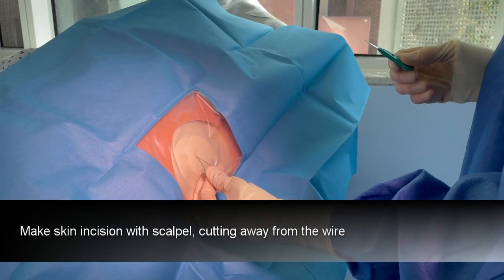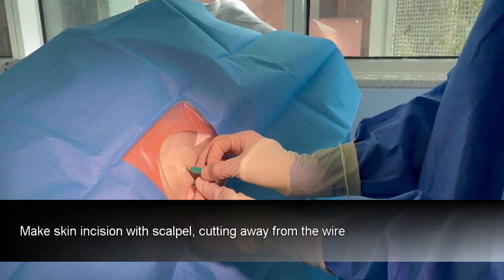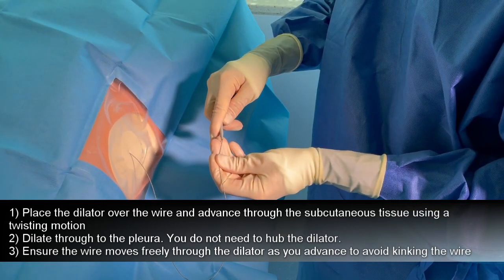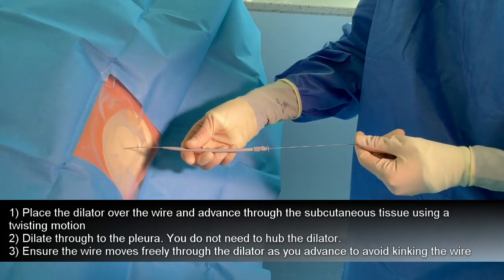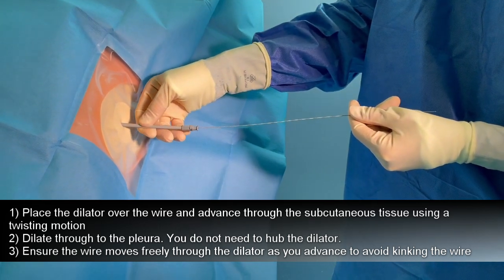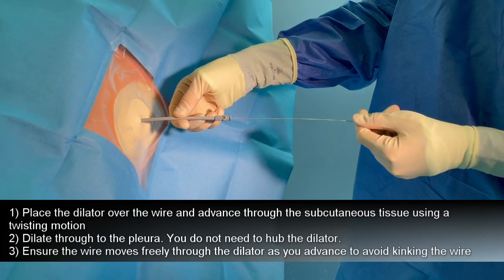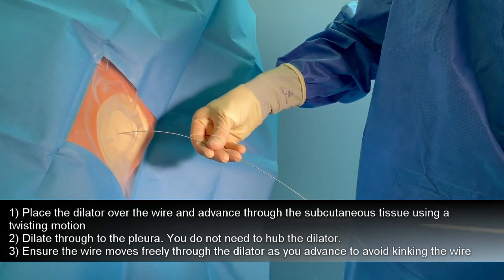Next, using your scalpel, make a skin incision, carefully going away from the wire. Take your dilator and place it over the wire. Advance the dilator over the wire through the subcutaneous tissue in a rotating fashion until it just enters the pleural space. Remove the dilator. Again, ensure that your wire moves freely.